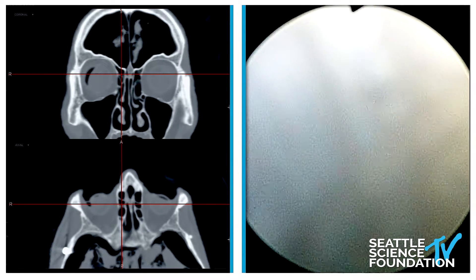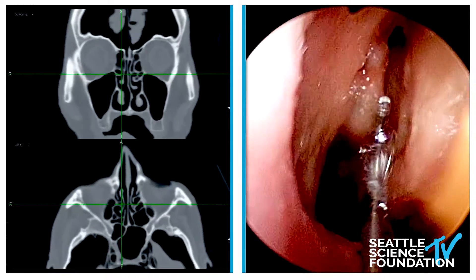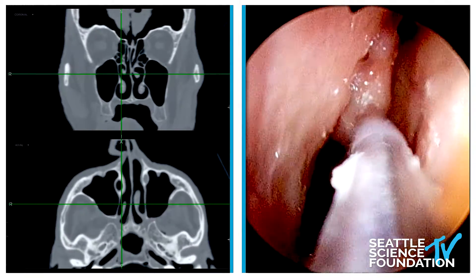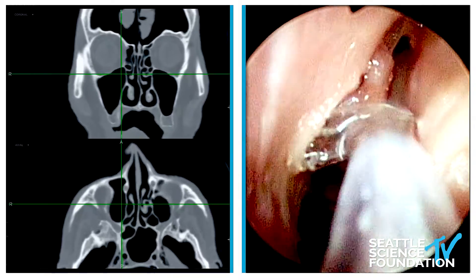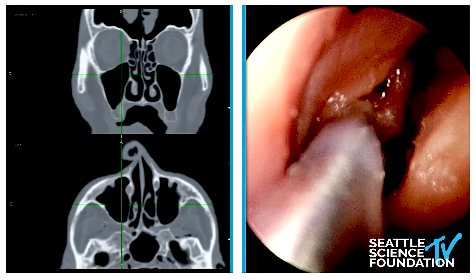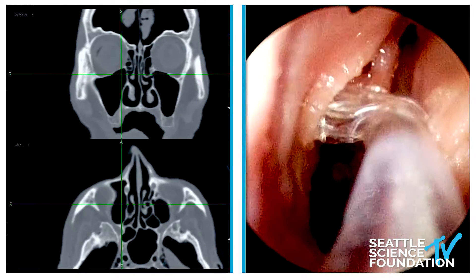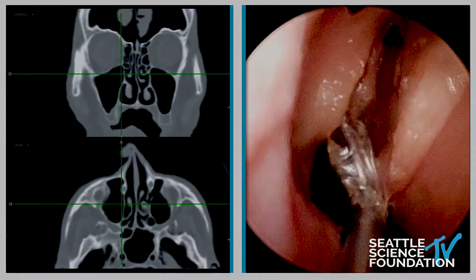And then the final one — by this point, the maxillary is usually pretty easy. Two ways: some people like going in with it facing up, some people like going in facing down — just see what works. A lot of times the bulla gets in the way, so sometimes you have to crush the bulla to give you some space. I prefer going in with the balloon pointed up and just hooking it like it's a ball-tip seeker. The ostium comes down to about 8 o'clock on the patient's right and about 4 o'clock on the patient's left. So always come in and go at an 8 o'clock or 4 o'clock trajectory.